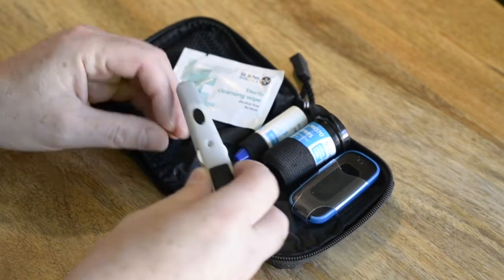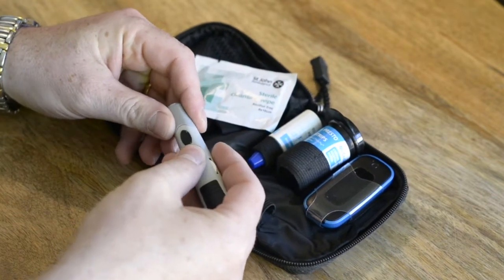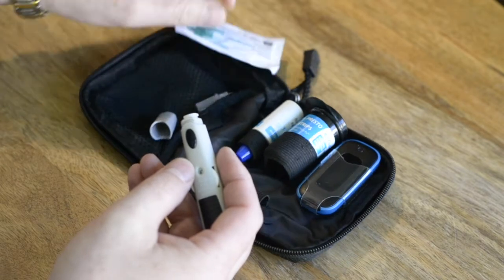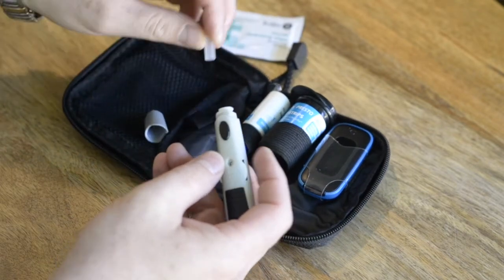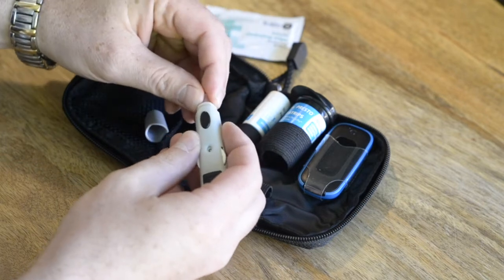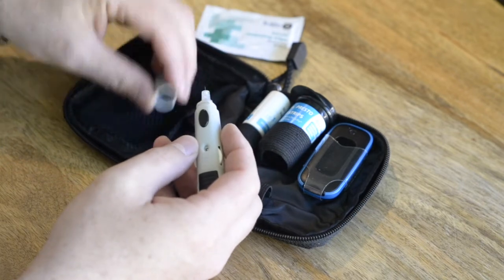First, let's prepare the lancet. Remove the grey cap on the end of the lancet and insert a clean needle cartridge. Then replace the cap.